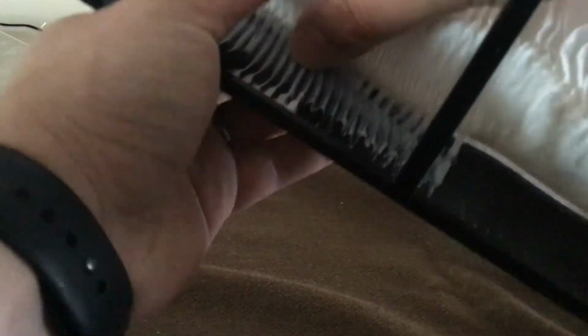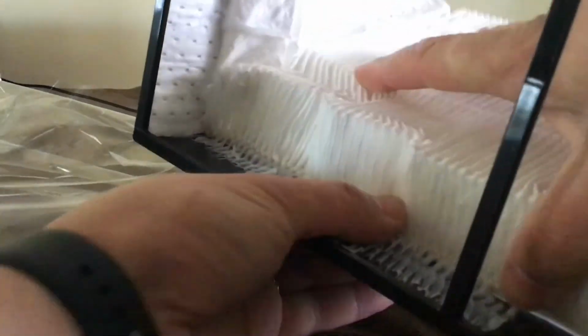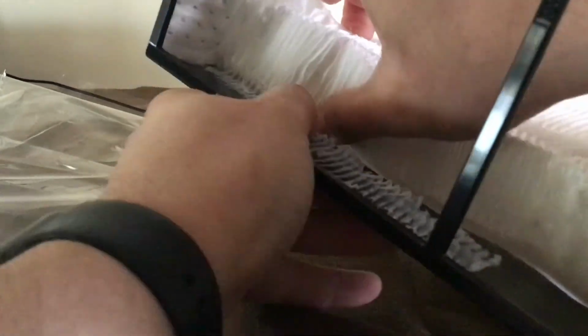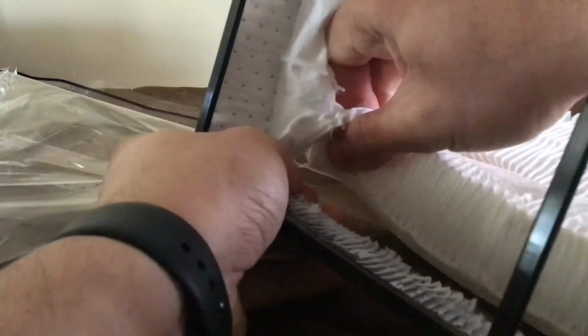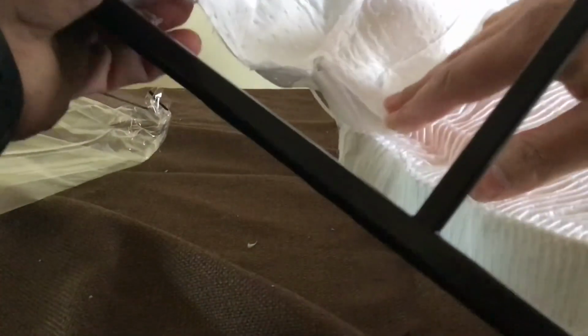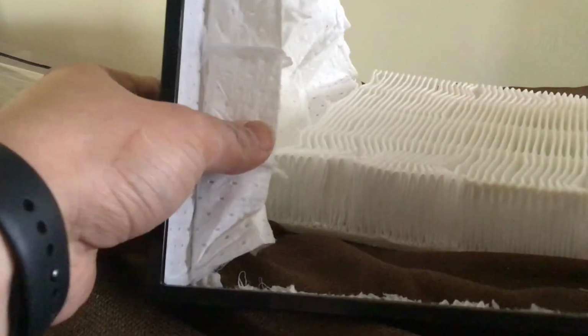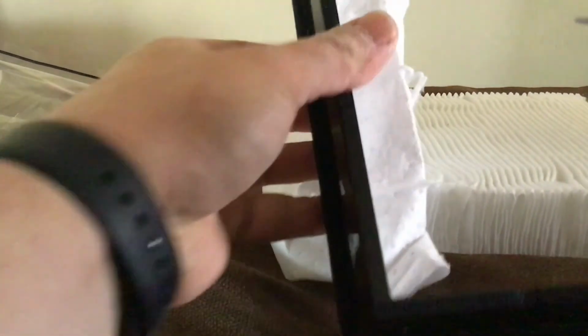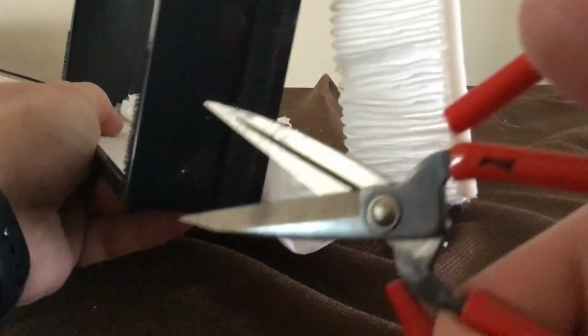Got it off the wall of the filter frame, and now we just need to pull it the rest of the way. So it comes undone from its glue. Pulling from the bottom seems to work a little bit better than from the top. And now we have all of the filter pleats available to us. So we're going to cut these glued portions out of the frame. Coming up from the bottom here, like so.